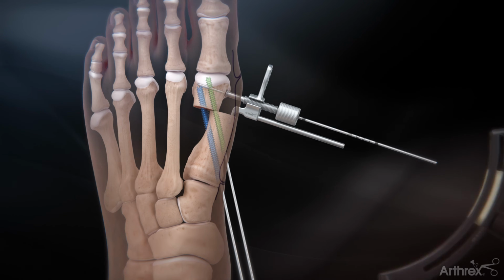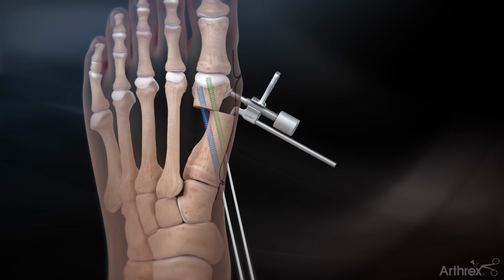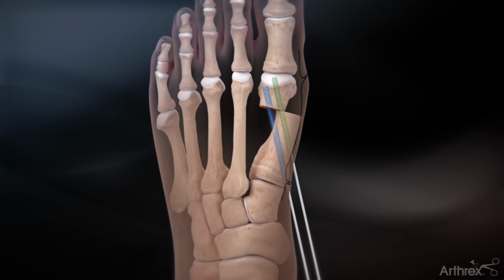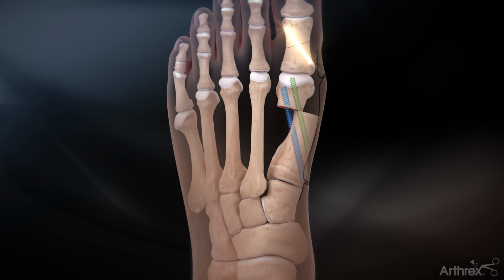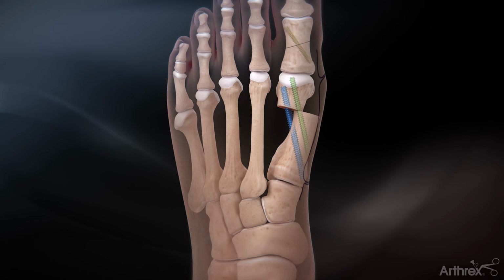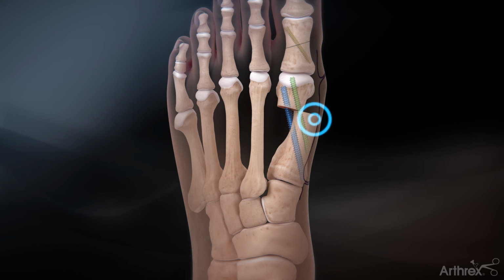Once both screws have been placed, remove the guide and shifting device. An akin osteotomy is also recommended for this procedure for complete correction. Finally, if necessary, this bone shelf is removed with a burr or rasp.